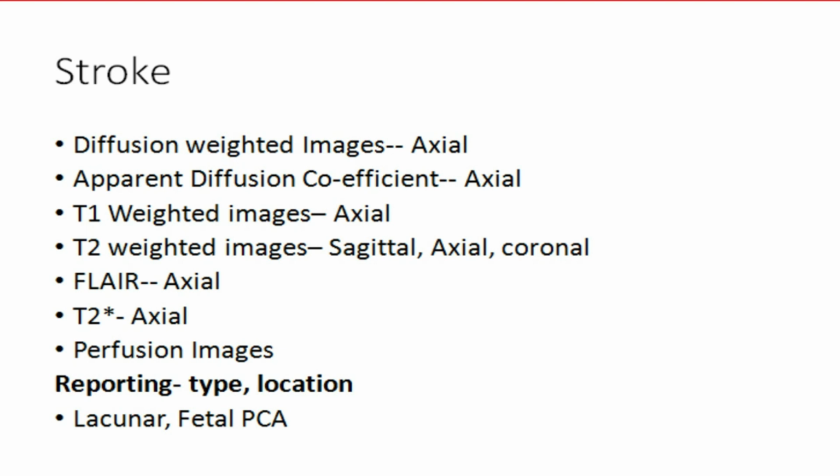Okay. Now, coming to my point of why we need to do the T2 weighted images in all three sections. One of my senior colleagues, a consultant who is very well published, used to say this is the angiogram of a poor man. That will give you the idea of the vasculature, even if you're not able to get the CTA, because the CTA involves many more things: infusion pump, correct timing, good ejection fraction, all those factors.